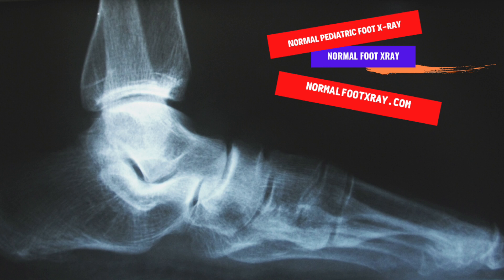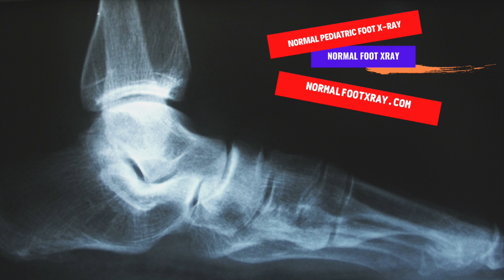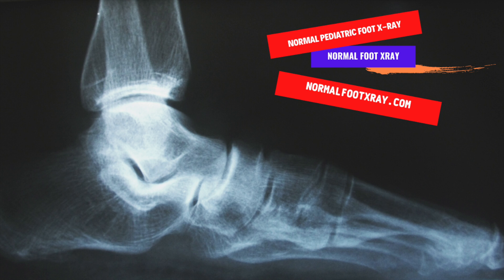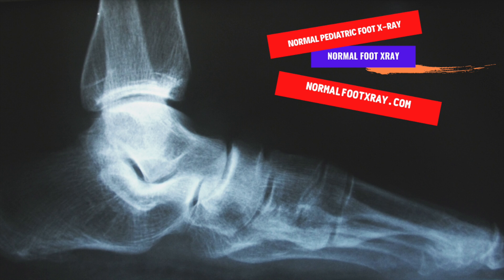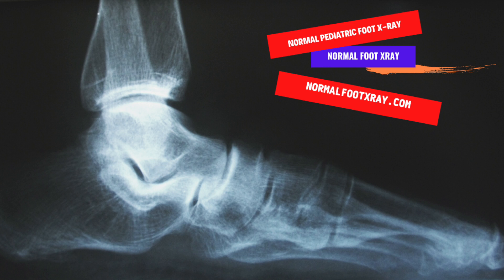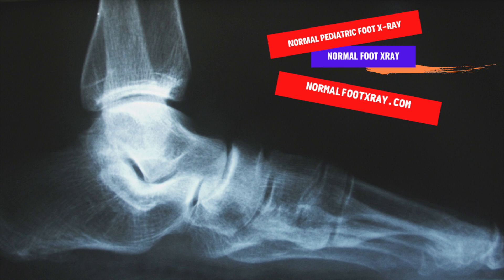The lateral and dorsiplantar views are the most common radiographic examinations of the foot. A child's ankle and foot should always be positioned firmly on a table. The lateral and dorsiplantar views are not suitable for evaluating the position of the ankle joint. The AP view should be angled 15 degrees toward the heel to minimize the overlap between the lower leg and the posterior foot.